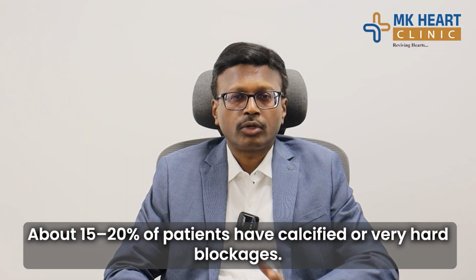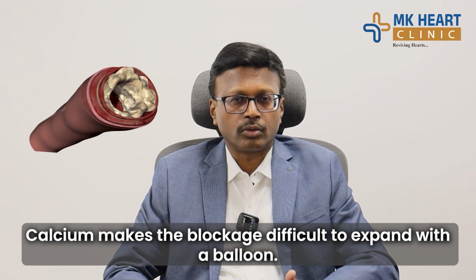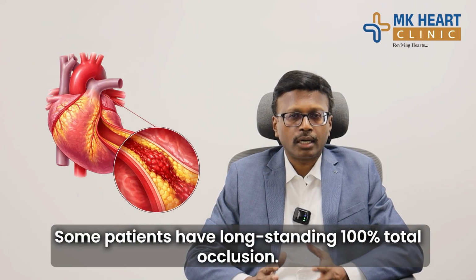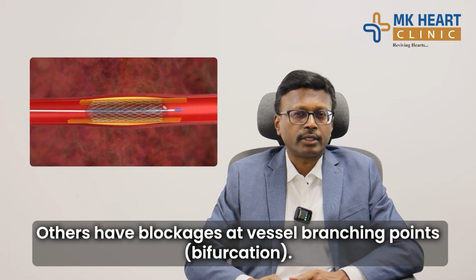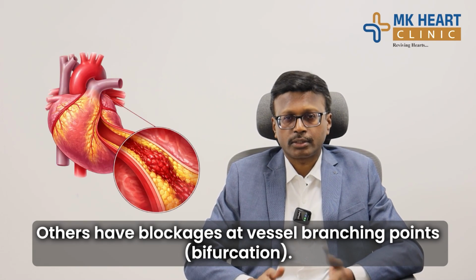In 15 to 20% of the individuals, the blockage may happen with calcium accumulation also, which is called the calcified lesion. In certain patients, the blockage will be very hard and it will be 100% total occlusion. We need to use multiple wires, smaller balloons, specific imaging devices. So chronic total occlusion is a component of a complex angioplasty.